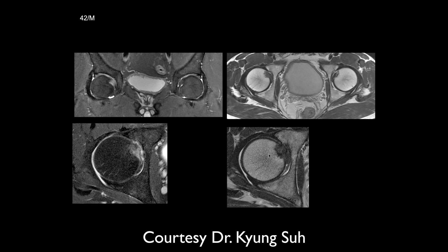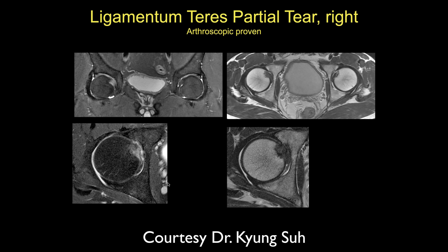In the next case, there is thickening and edema involving the ligamentum teres on the right side. There is also reactive bone marrow edema adjacent to it. This appears to be an acute tear or partial tear of the ligamentum teres.